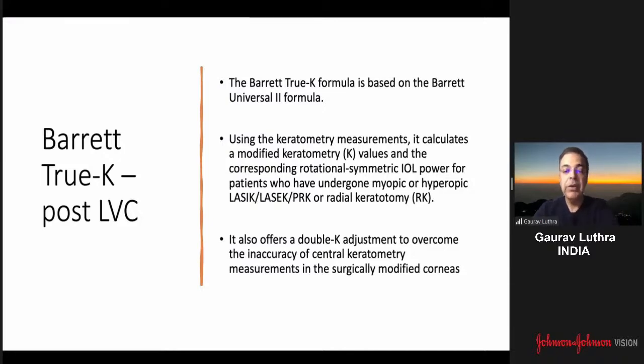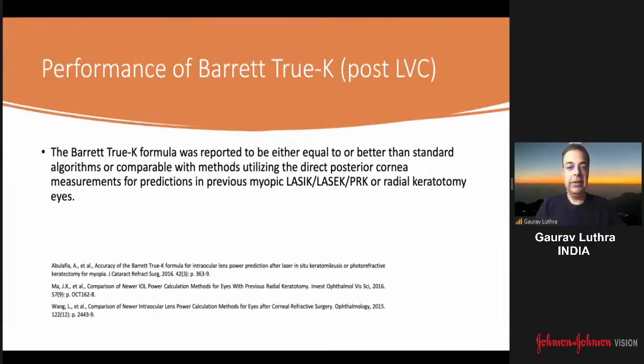And then, of course, coming on to post-refractive surgery, I think the True K formula is something which is very, very useful today. And amongst the gamut of a few formulas which are there on the ASCRS calculator, as well as on our machines, such as the Shammas and the True K, we really have started using more and more of the Barrett's True K post-laser vision correction formula. I will not go into the details for the sake of brevity, and it does perform well.